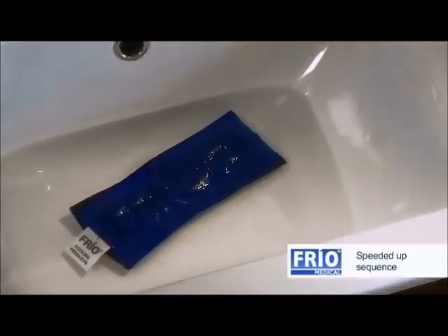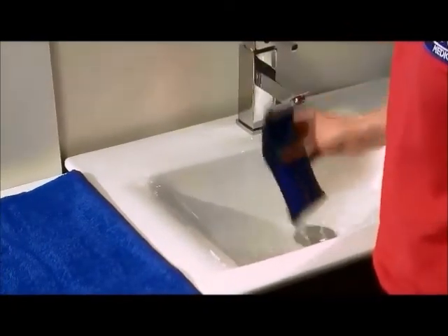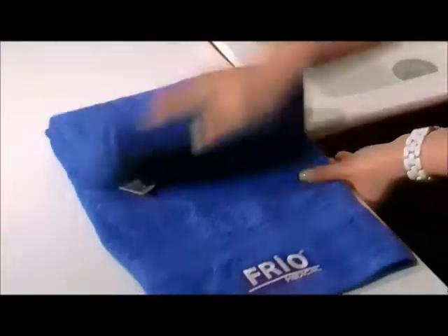You will notice the panels will expand. When the panels have completely expanded, the wallet is taken out of the water and pat-dried with a towel.